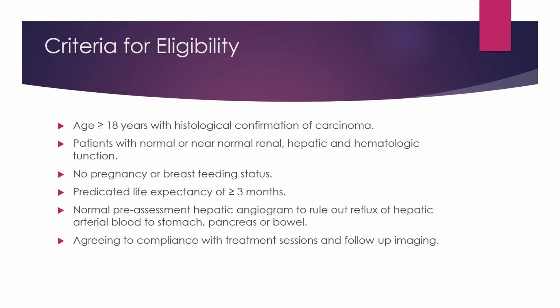patients with normal pre-assessment hepatic angiogram, which rules out reflux of hepatic arterial blood to stomach, pancreas, or bowel, patients who agree to comply with treatment sessions and follow-up imaging.